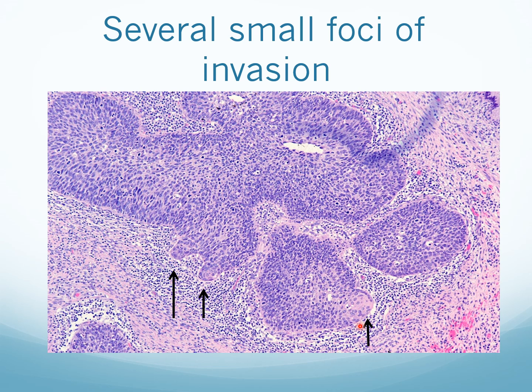And in cytology, you will be able to see cells in squamous cell carcinoma that show this paradoxical differentiation. They start to look like tadpoles and elongated cells, and some of them have quite pink, copious cytoplasm. This change can indicate that there is early squamous cell carcinoma invading the underlying stroma.